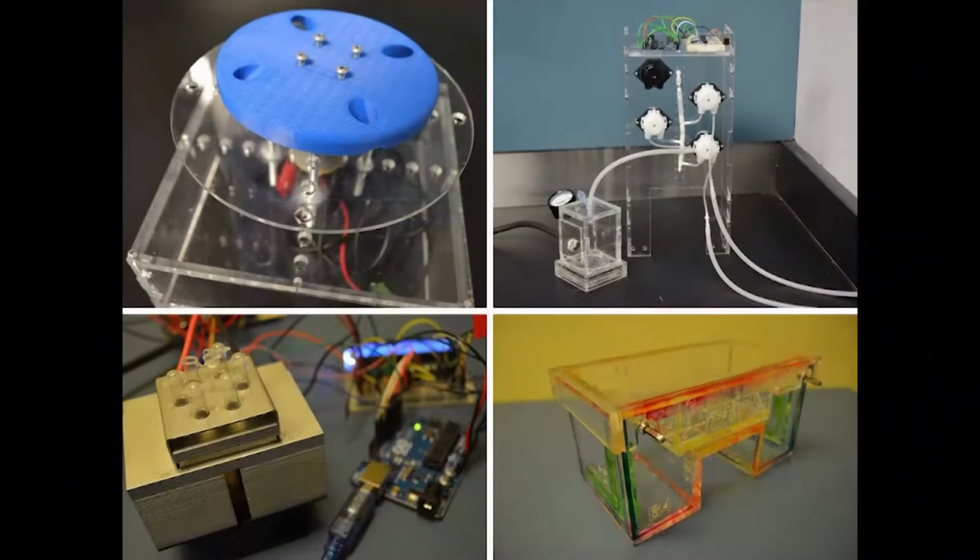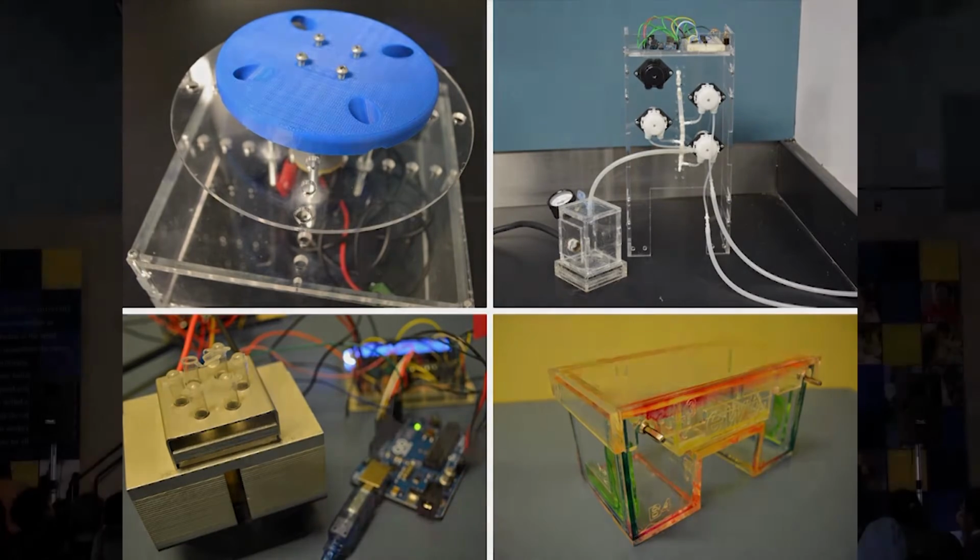Here you can see the 4 components of our device. We're obviously in a prototype stage, and I will tell you a little bit about the overview of how each of these works. The first device on the top left is a centrifuge. This processes the blood. The next step is a pump system to extract and purify the RNA. The third, on the bottom left, is a thermal cycler that runs a polymerase chain reaction that can amplify a gene specific to HIV. And lastly is a gel box that runs gel electrophoresis to visualize the results.